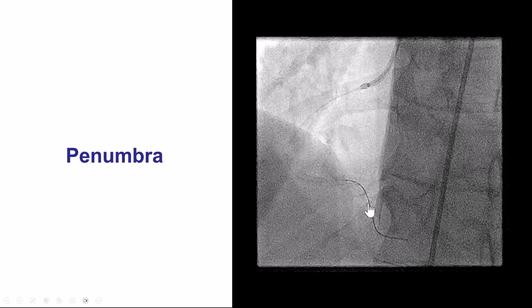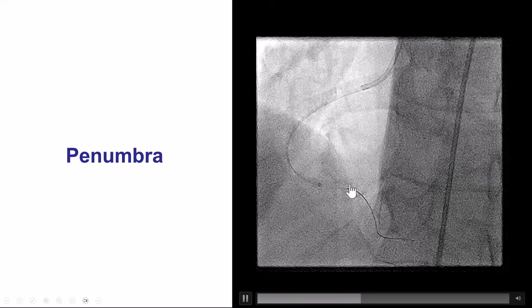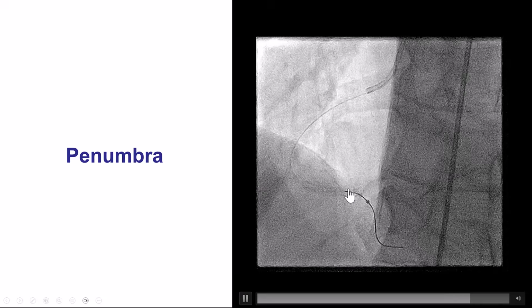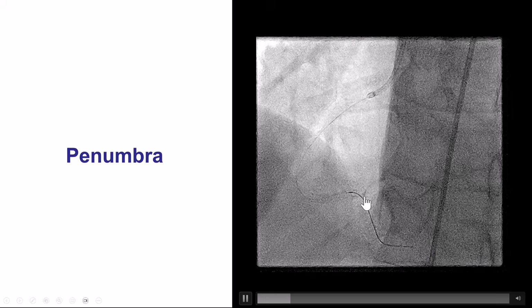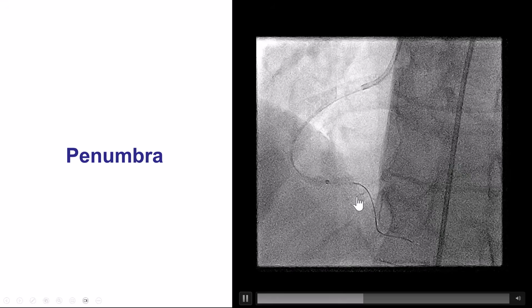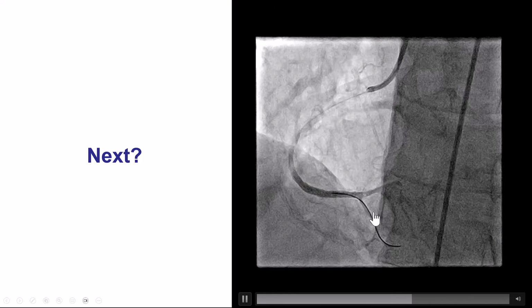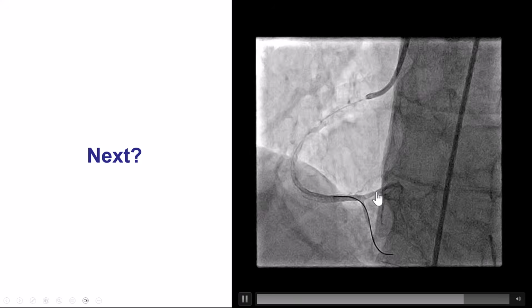So what we did is aspiration thrombectomy. We used the Penumbra, and it was advanced inside the PDA. Before treating with the stent, the Penumbra catheter would not cross into the PDA, but now that the distal RCA was stented, we were able to very nicely deliver the aspiration catheter into the PDA and did multiple passes. However, we didn't see any visible thrombus retrieved through the Penumbra system. So now the PDA looks okay, but we can't have this clot migration, there's thrombus into the right posterolateral.